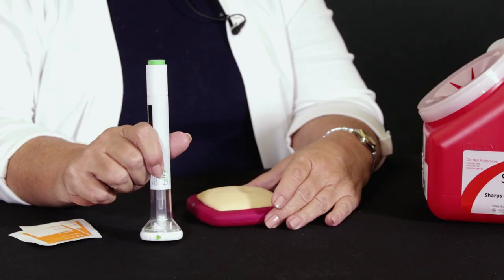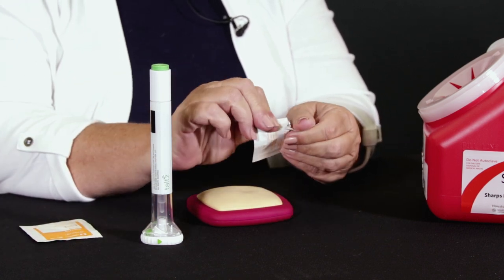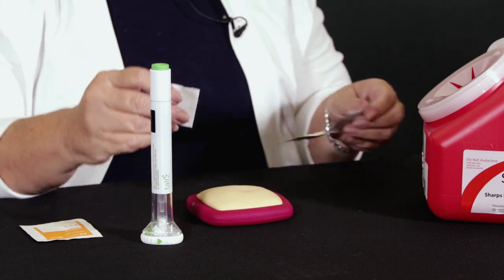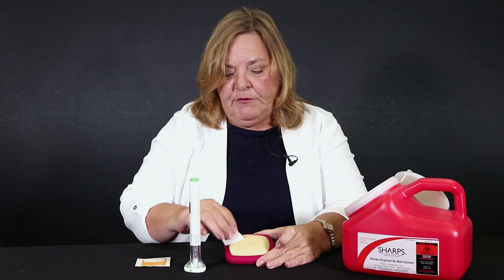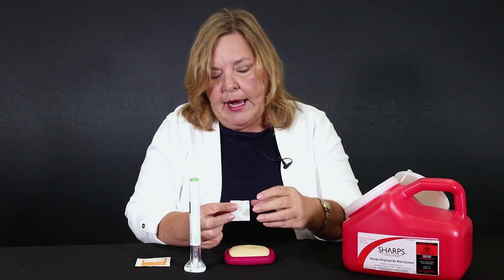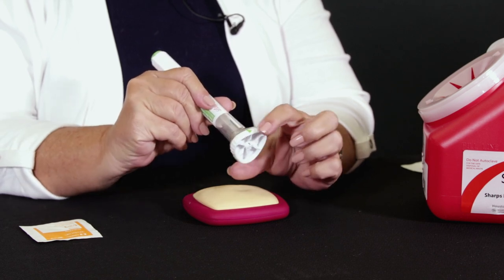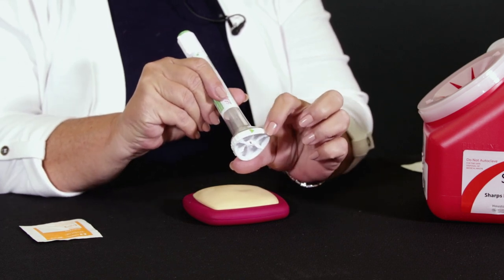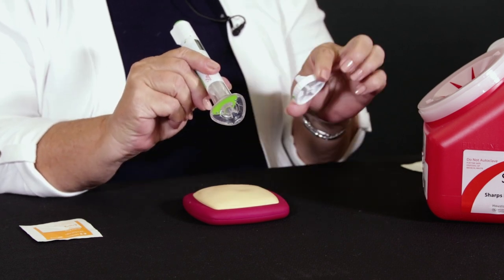So let's get started. You've decided where you're going to do your injection. Say it's your belly and you're going to clean that with an alcohol wipe. If you don't have alcohol wipes like this, that's fine — you can use rubbing alcohol and a cotton ball. The next thing you're going to do is take off the cap. There's actually a little arrow which points in the direction of the cap removal. It just twists right off.